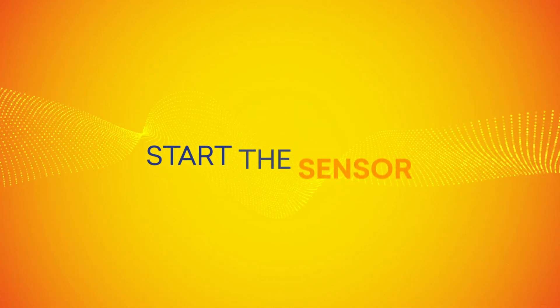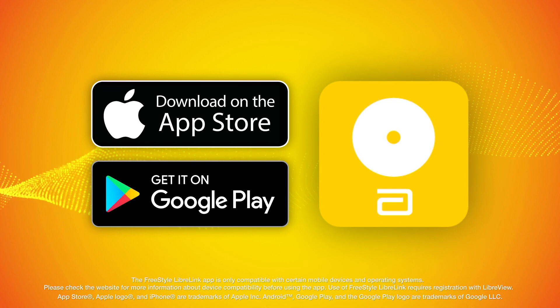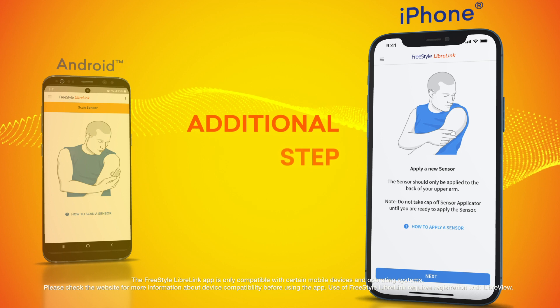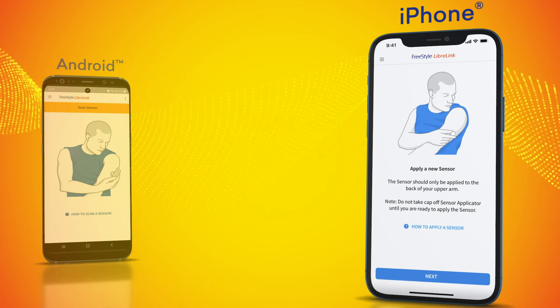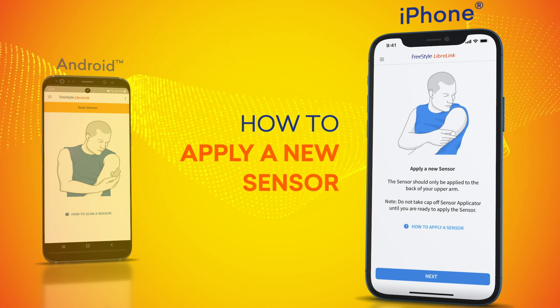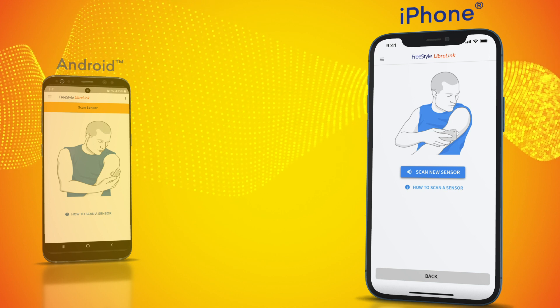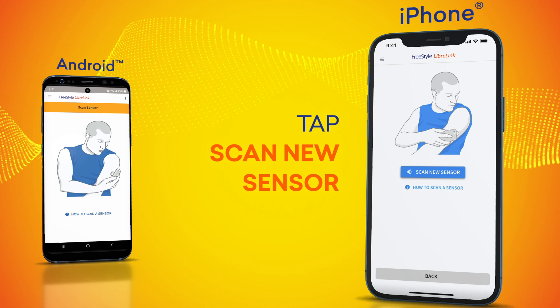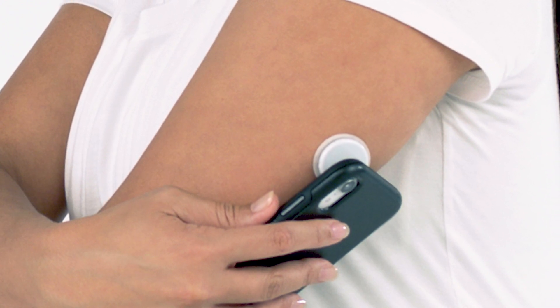All that's left is to start the sensor. After you've downloaded and started the FreeStyle Libre Link app, you will need to scan to start your new sensor. On the iPhone, there's an additional step. Once you've logged in or created a new account, the app will bring you to the 'How to apply a sensor' screen on your phone. Tap next. An image of a person holding the phone next to a sensor on the arm will appear. Tap scan new sensor.